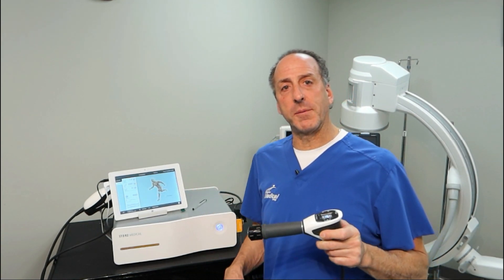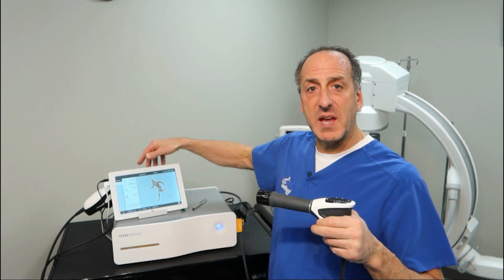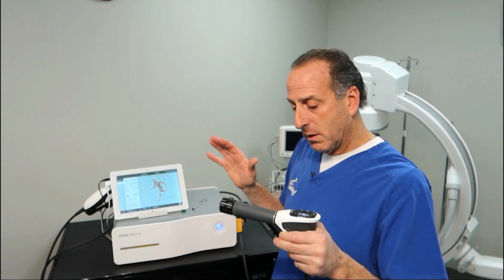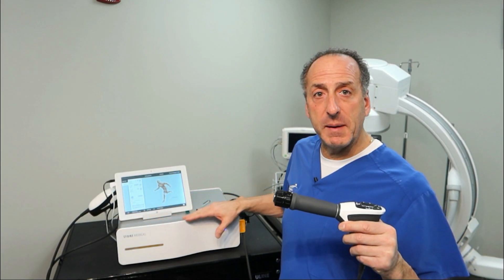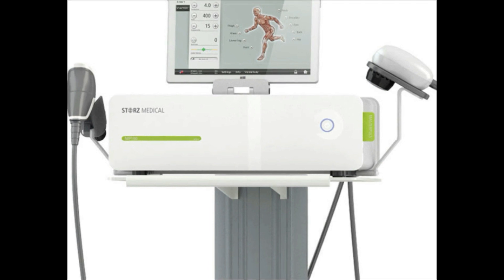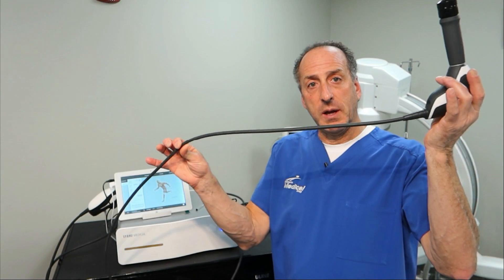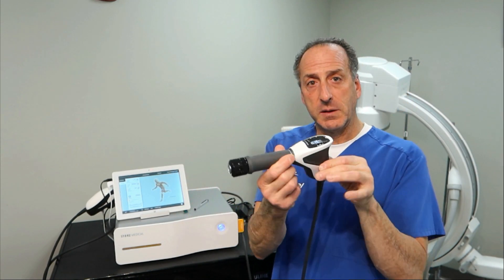So I want to explain the equipment here. There are really three parts to this shockwave system. We have the tablet, which you can see on the computer here, which records all the information about the treatment. We have the wand in my hand here, which has controls as well. We have the transmitter, which is the tip. And then we have the main base, which is the brains behind the entire system — it's also housing an air compressor. The air compressor runs from the back of the unit through a tube to this wand.